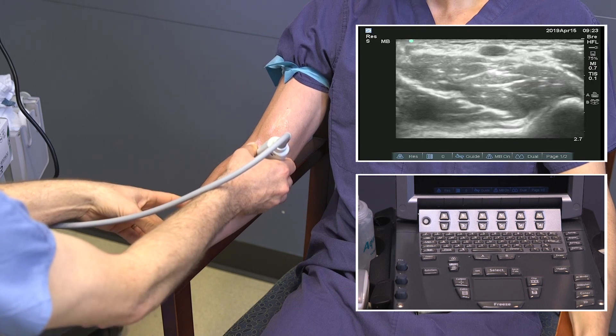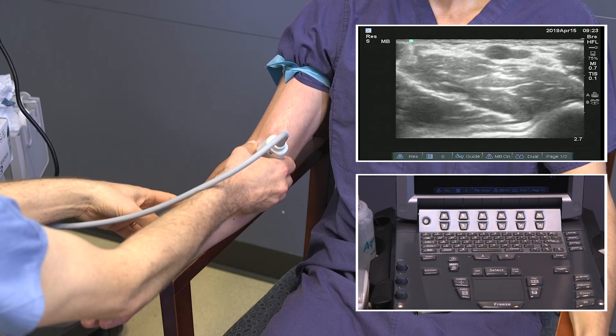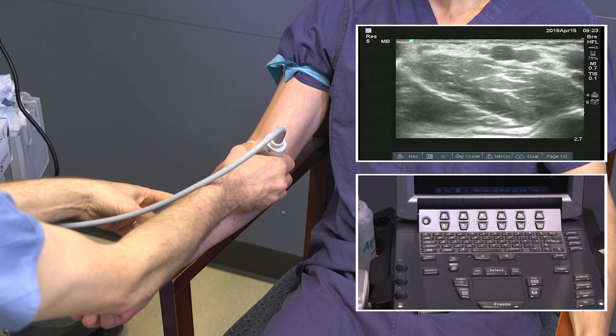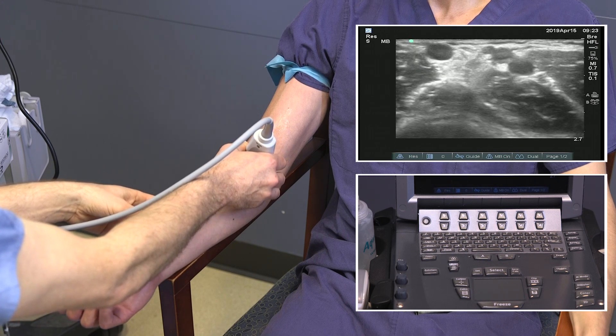Next, we're going to look at the arterial system. Here we see a single brachial artery, which is soft, compressible, and not heavily calcified.